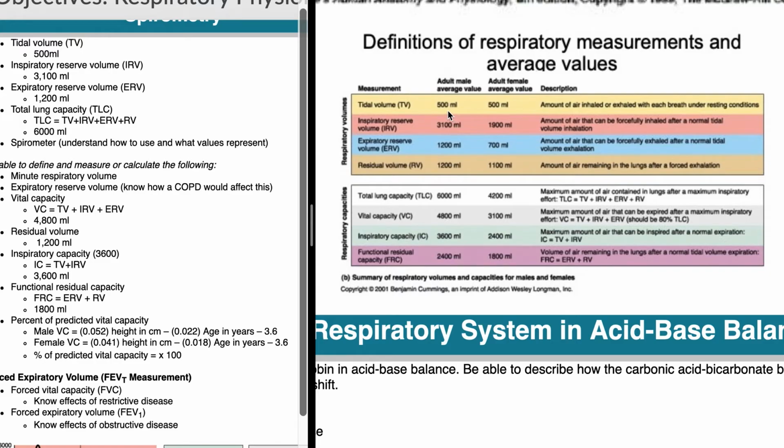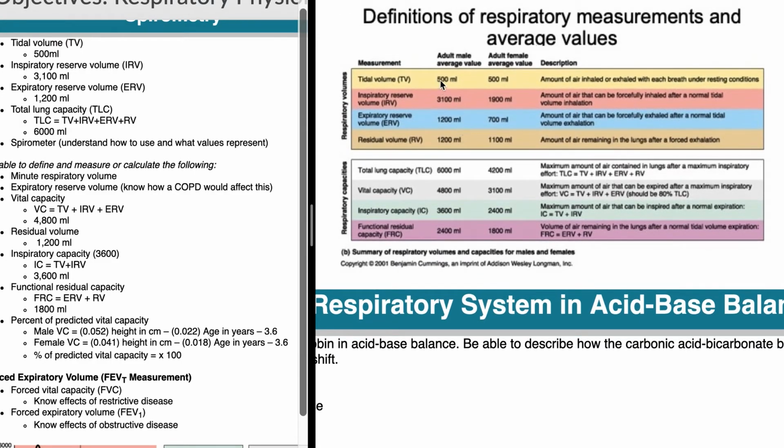Notice when you look through these numbers, 500 and 500, tidal volume doesn't take much muscle mass and doesn't use much of your lung volume. So there's actually no difference at rest. The differences emerge during the things that are dependent upon the size of your lungs and the muscular force that you can produce around your lungs. And inspiratory reserve is your biggest difference there. So that's just sort of an FYI thing. And it is important, though, as you measure these volumes, to understand that height and muscular development make a big difference in how much somebody can breathe.